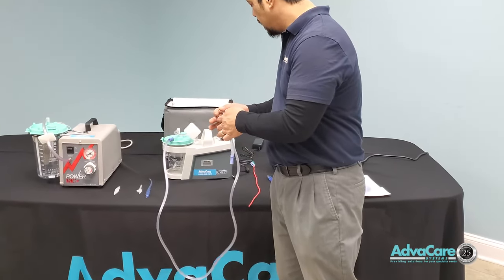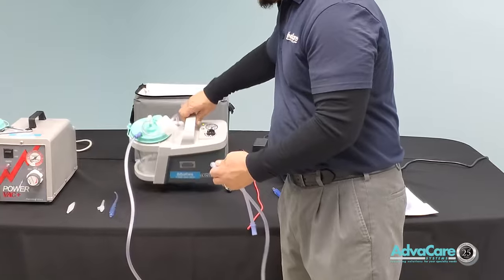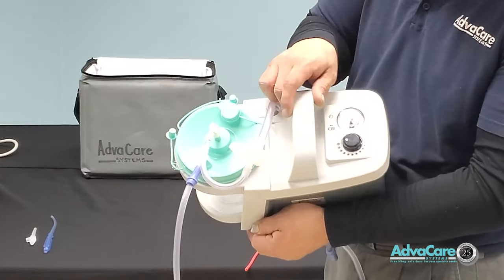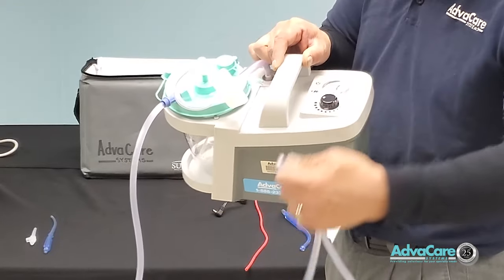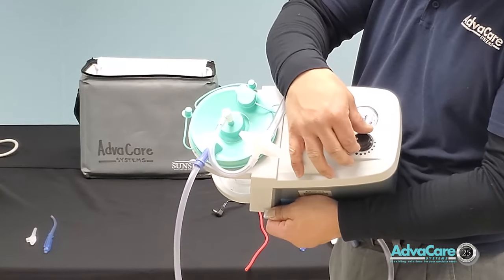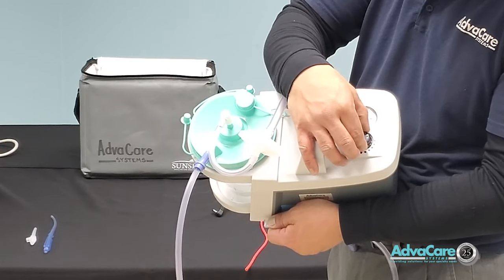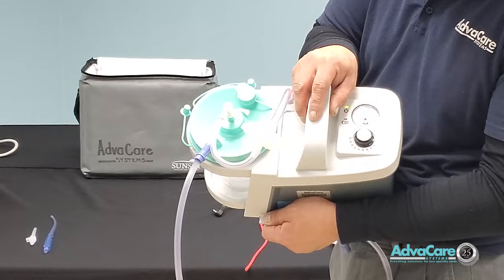The same rules apply: if you want to verify the pressure, first kink your tubing, then turn the control dial to increase or decrease your pressure for suction therapy.